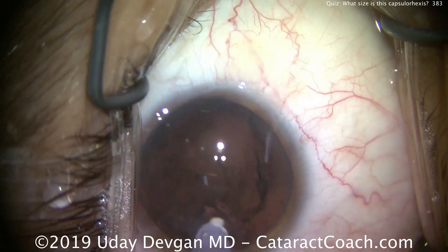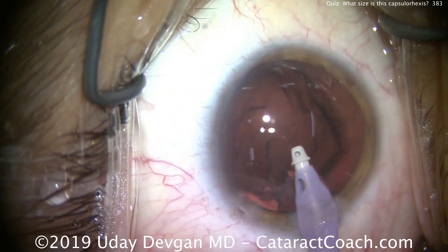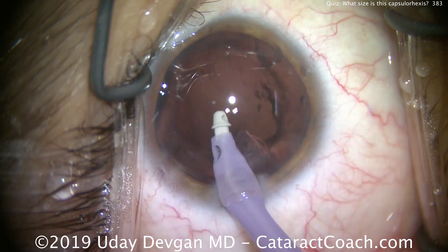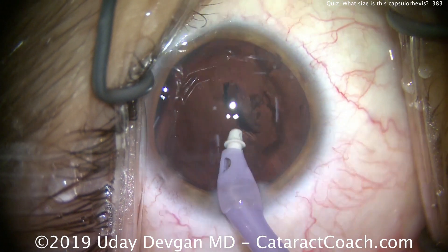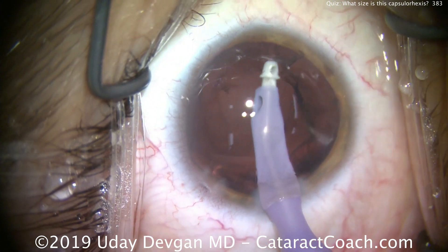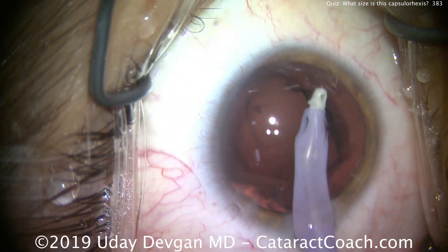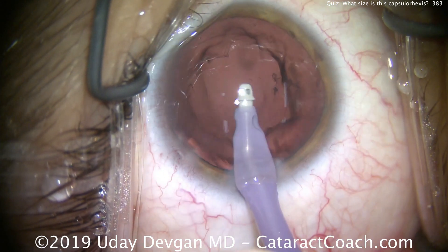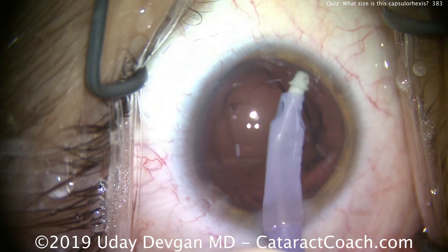We'll get a much better view here. Keep in mind, the reason we want the rhexis to overlap the optic is that it helps hold the IOL in a secure position, giving a more predictable effective lens position — important for lens calculations. We want to avoid too small a capsulorhexis.